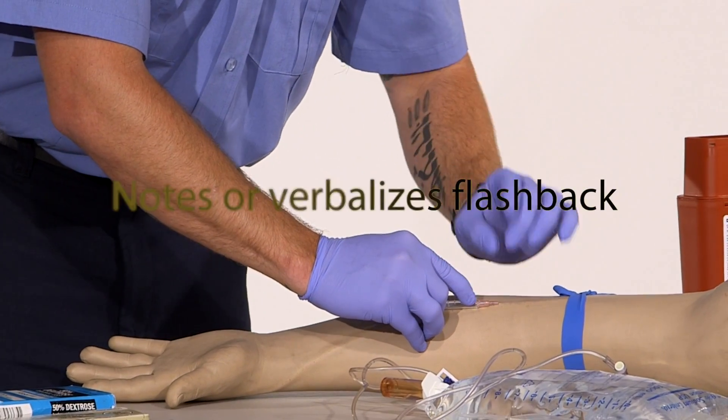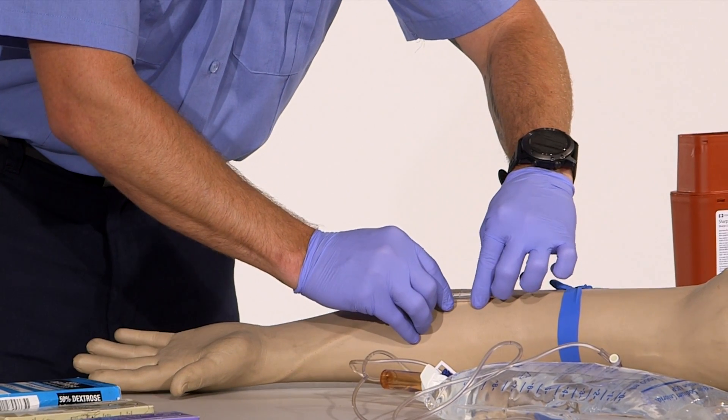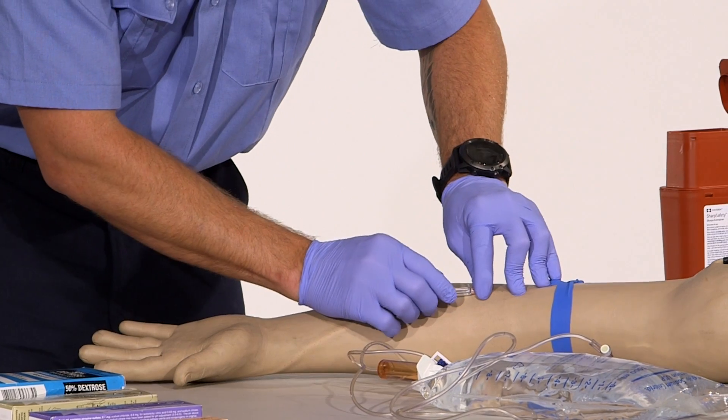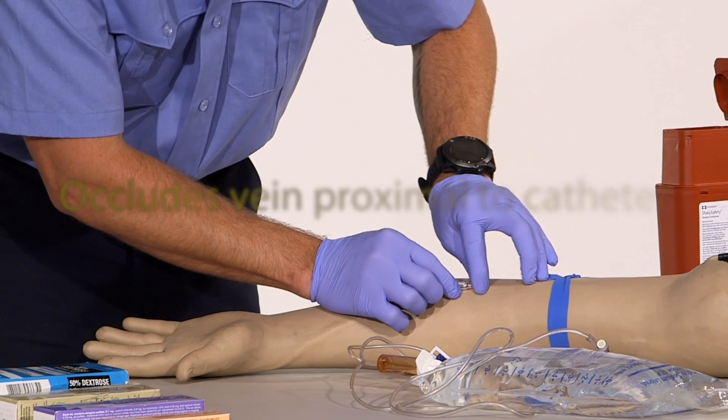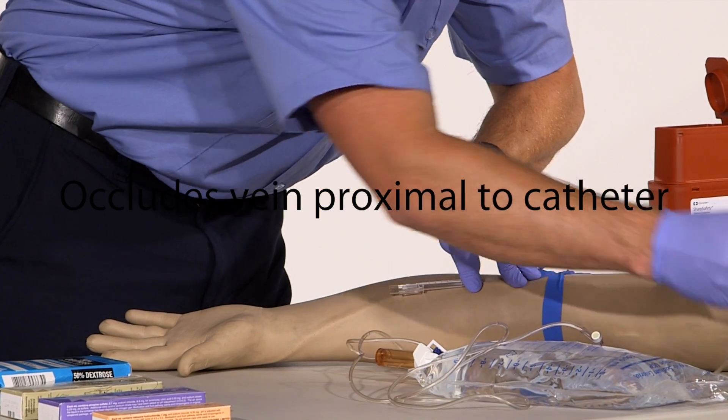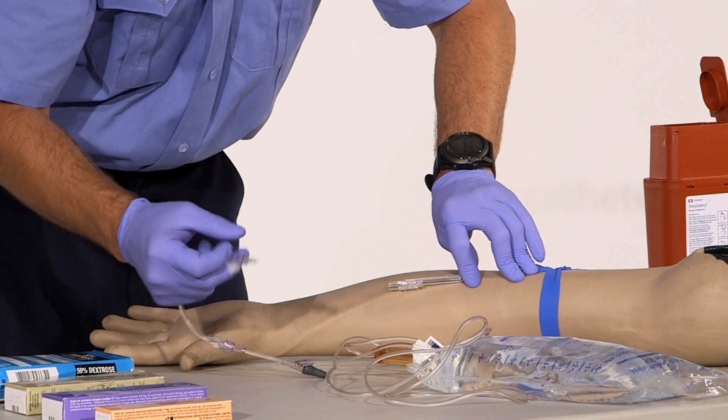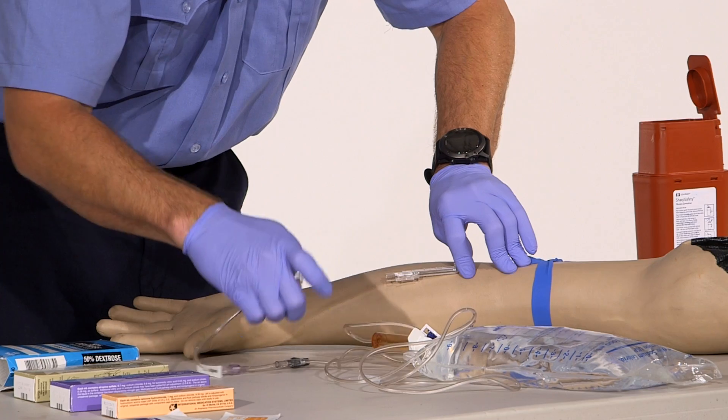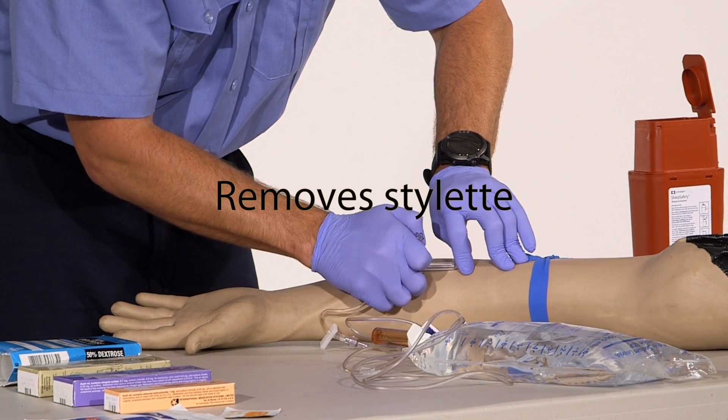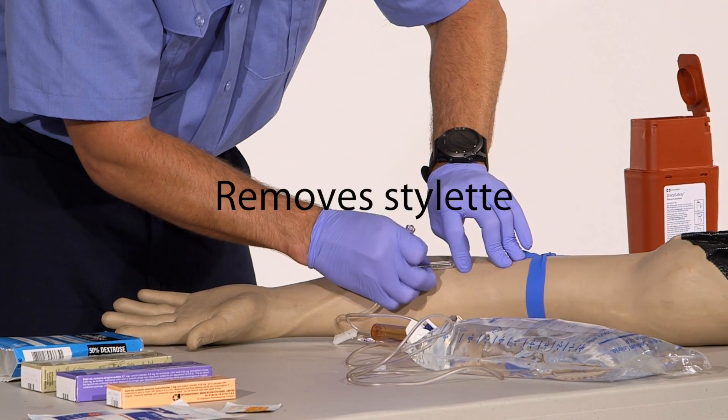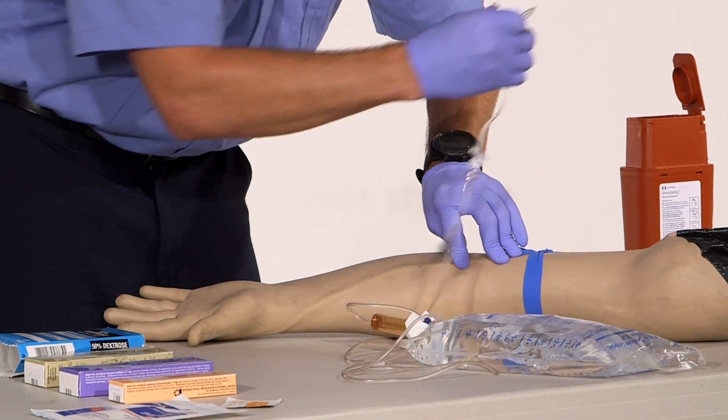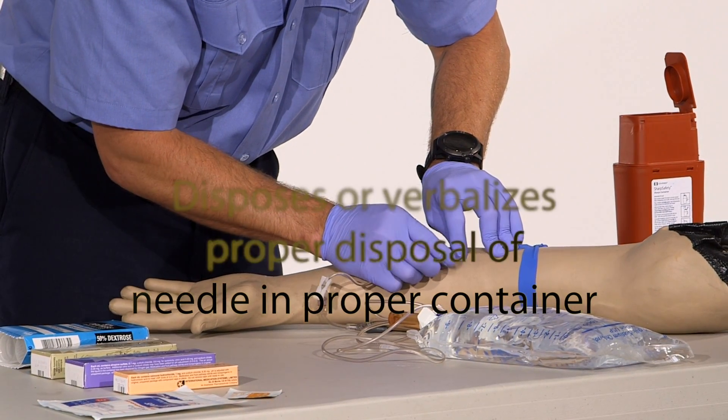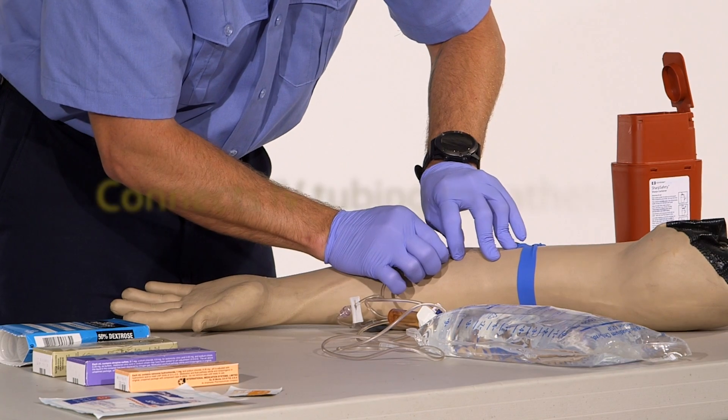I'm going to make sure that I keep secure hold of this. And occlude the vein. Keep the site clean. Remove the needle, place it into the sharps container, and get the drip set secured on there.